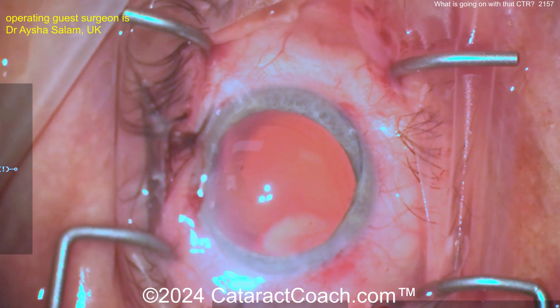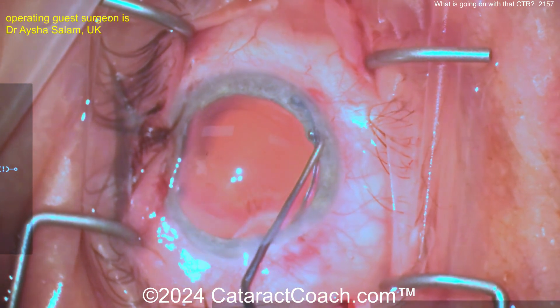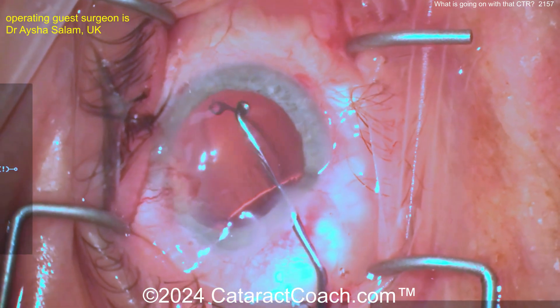The CTR can go to the posterior capsule and end up in the vitreous cavity — that'd be a hot mess, good luck trying to fix that. You're going to have to have your vitreoretinal colleague help you out. So let's show you a better way. Here it is, finally tucked in the capsular bag.